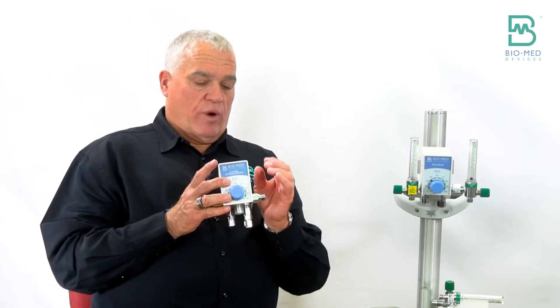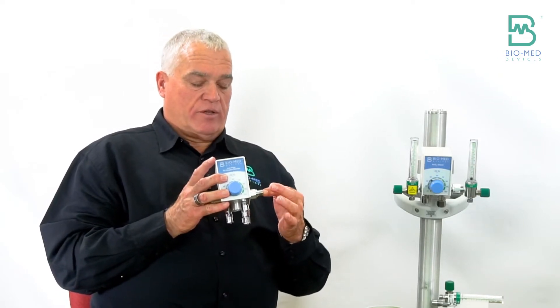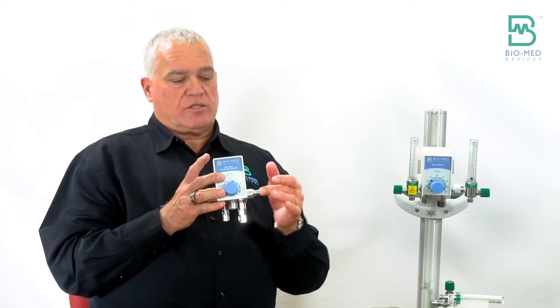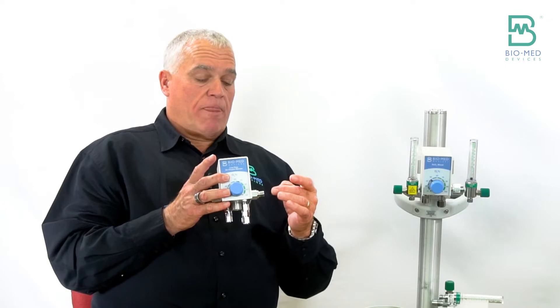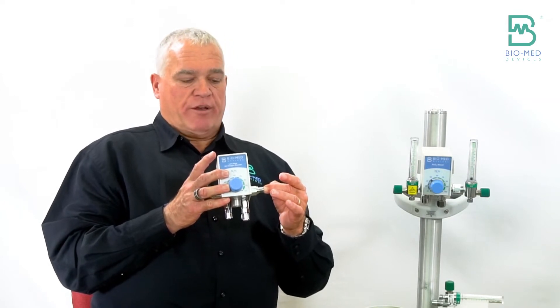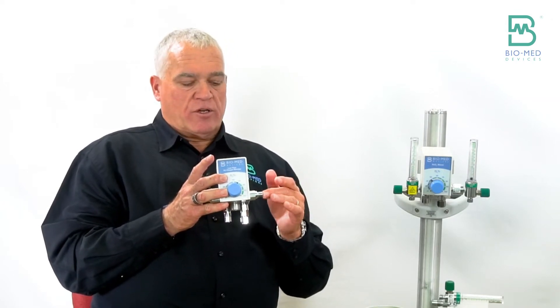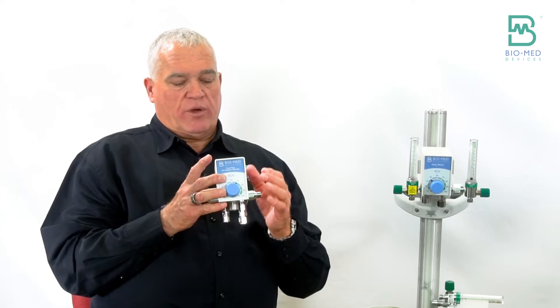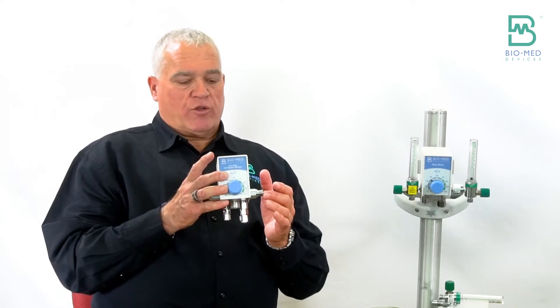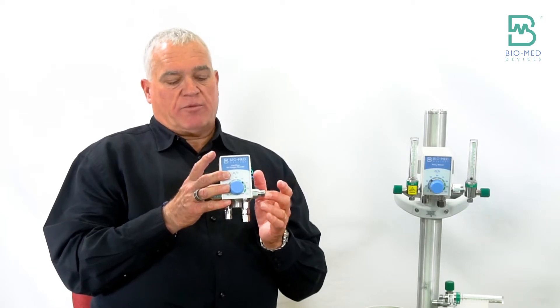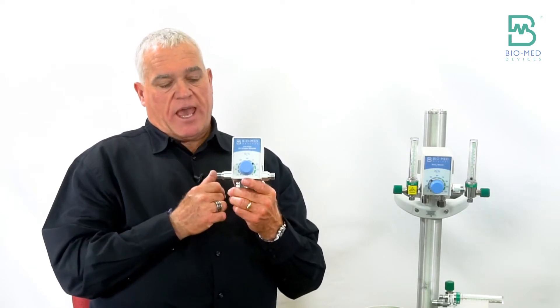The other thing is whenever you add a flow meter to this side of the blender, you activate a three liter bleed flow. Now three liters, it's not a lot of flow, but when you have a fifty bed unit and that flow is going 24/7, that ends up to be quite a lot of gas usage.